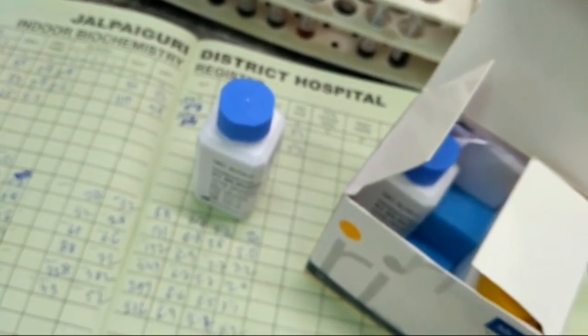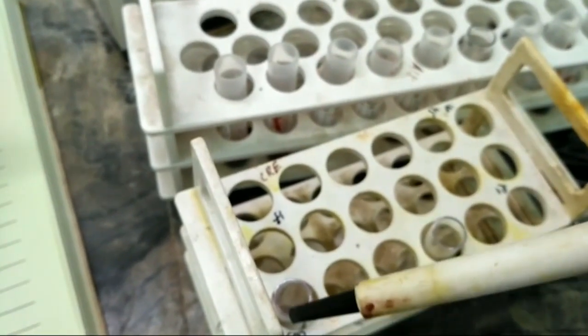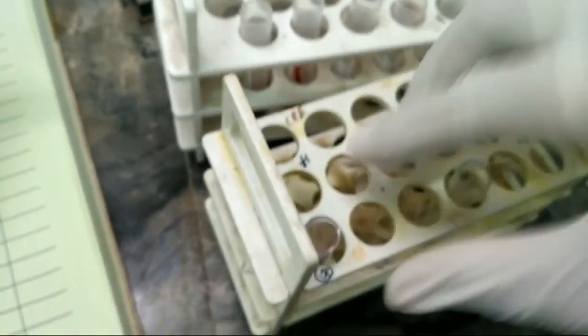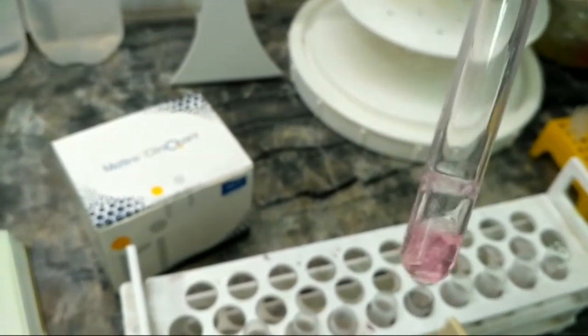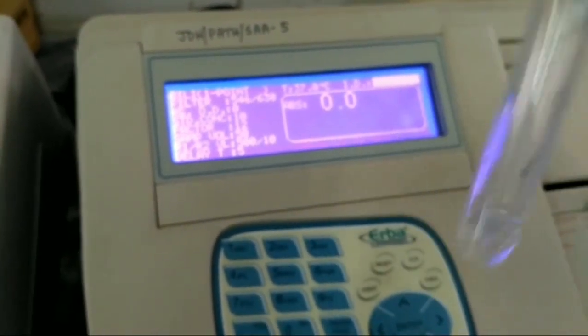When we add 50 microliters of the sample into this working reagent, the bilirubin will generate a purple color. The concentration of the color is directly proportional to the bilirubin present in the sample. Now we have to aspirate the reagent — this is the colorless reagent.